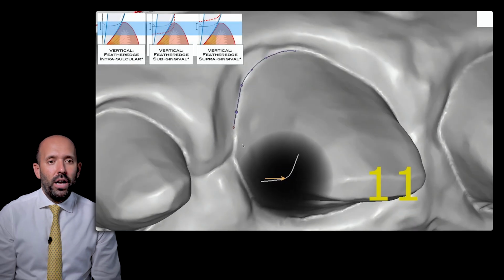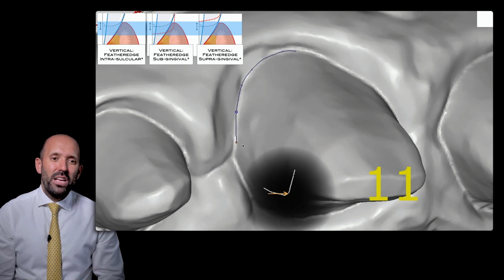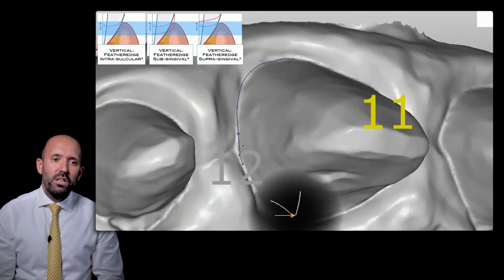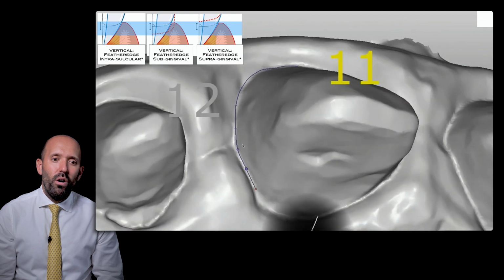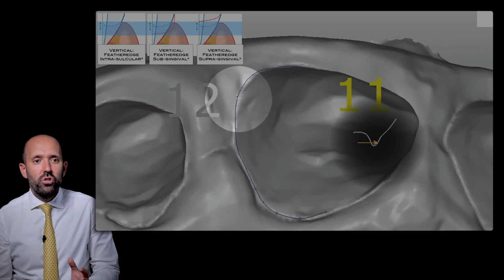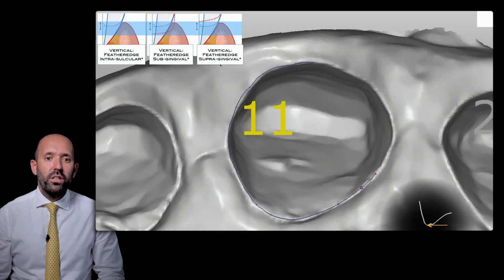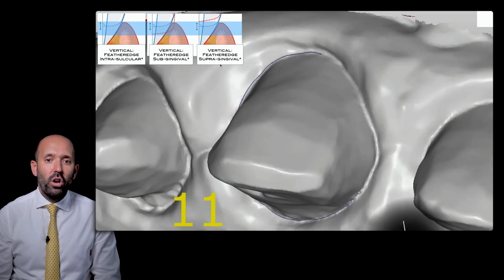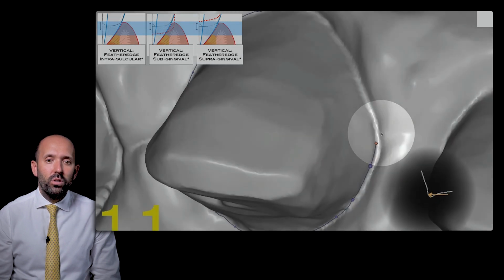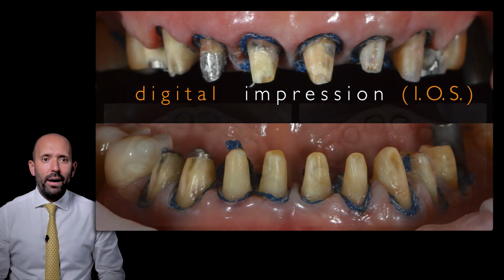The bottom of the sulcus is exactly where my provisional is arriving, maybe tenths of a millimeter shorter, but this doesn't make a difference. So we can draw our margin, but we can also capture all the information of the emergence profile of the provisional restoration and transfer this information to the dental technician. Of course, the sulcus must be wider at the top, 2 chords on the bottom.